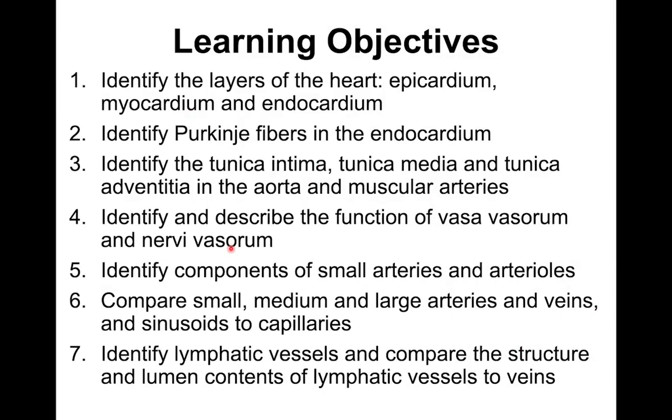So in today's lab session, by the end of this lab session, you'll be able to identify the 3 layers of the heart: the epicardium, myocardium, and endocardium. And we'll also discuss the Purkinje fibers, which are found in the endocardium. And we'll also see the layers of large and small blood vessels. And we'll also discuss lymphatic vessels.